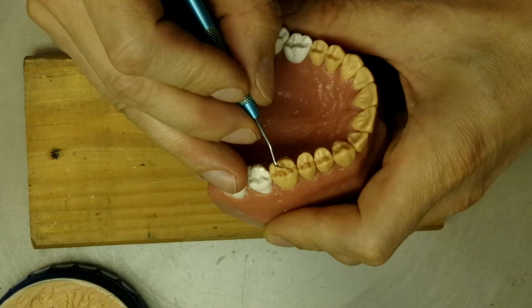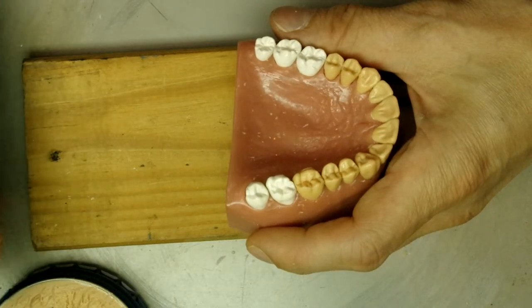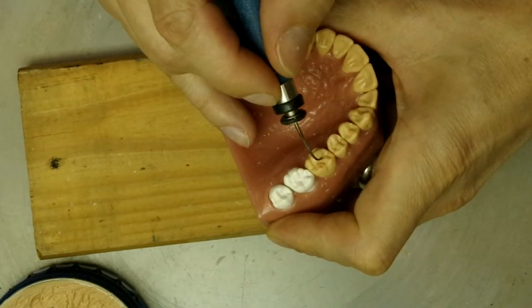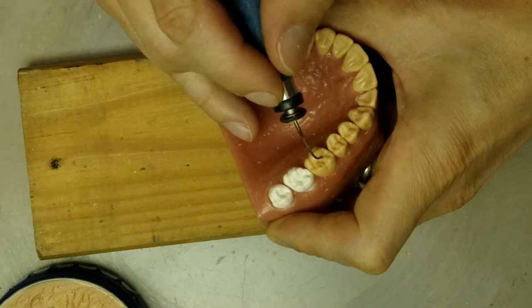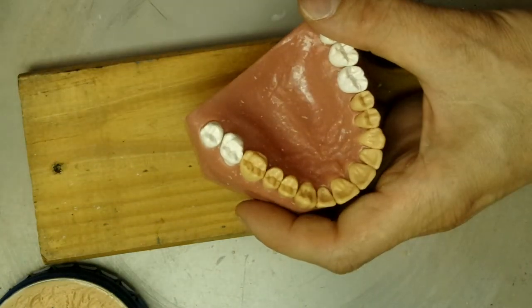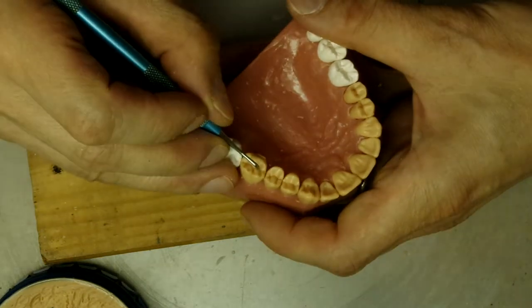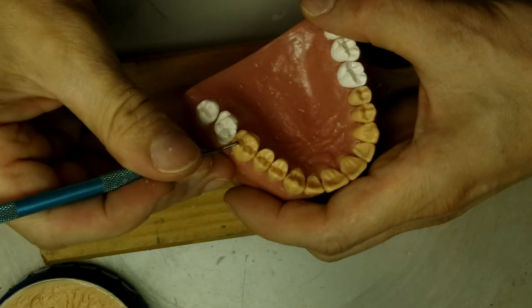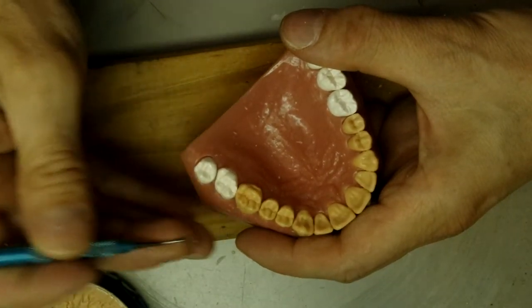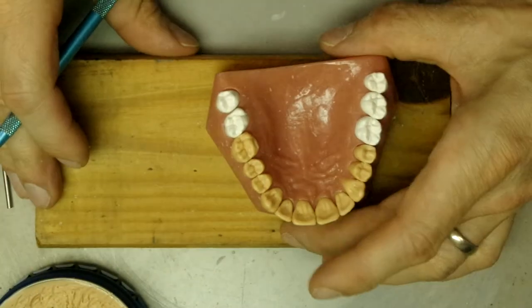Maybe we can fill this in right here just to close it up slightly. Then we'll sharpen it up a little bit, and that's your upper first molar right there.